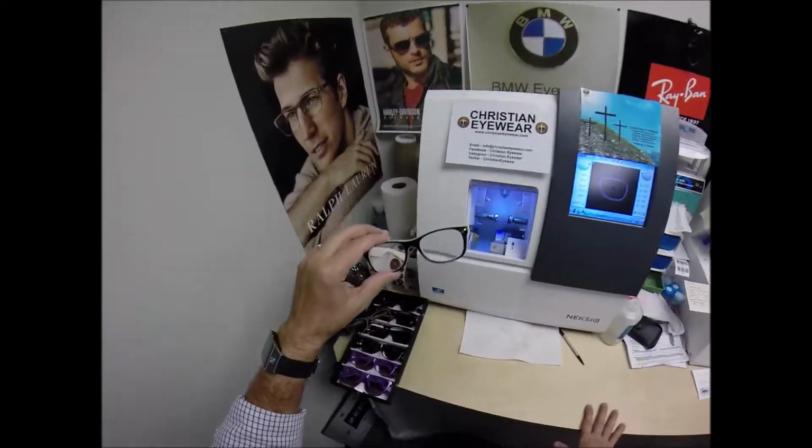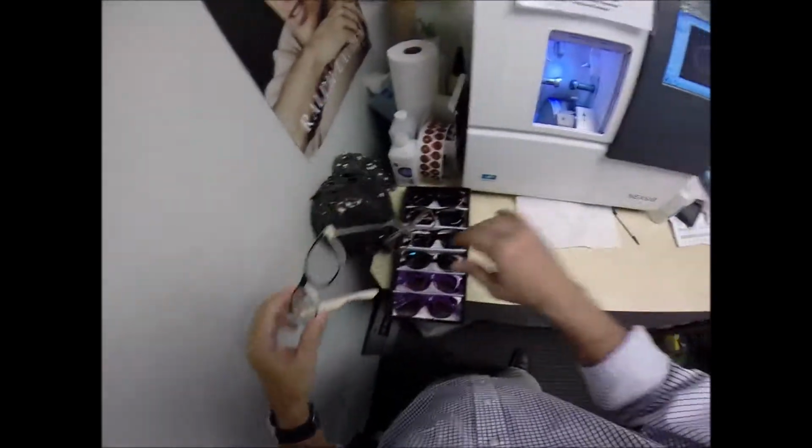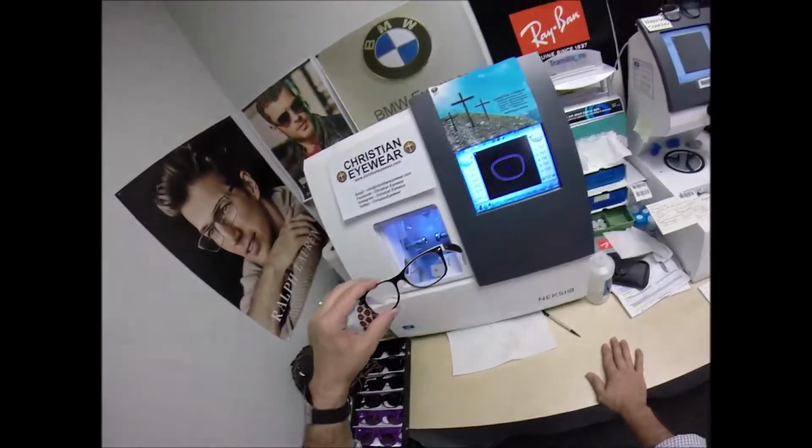Oh, so I was showing Brandi all this because she said her next pair might be that. And again, you can take the lenses out of this pair and put them right into there.